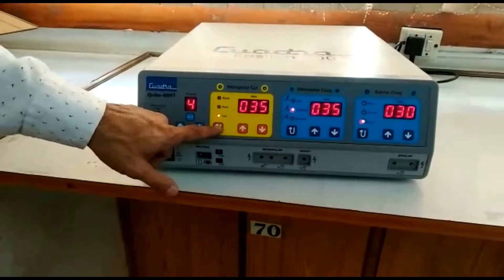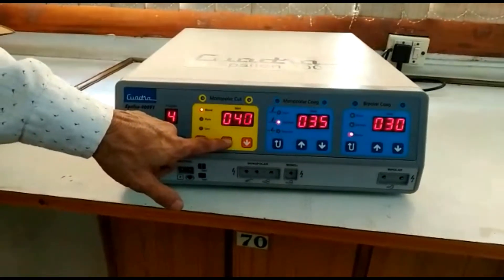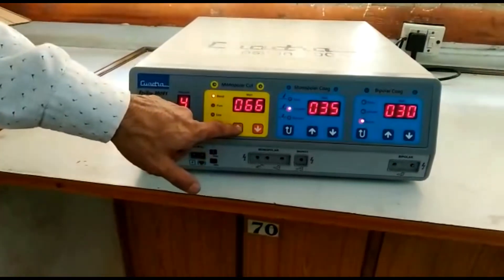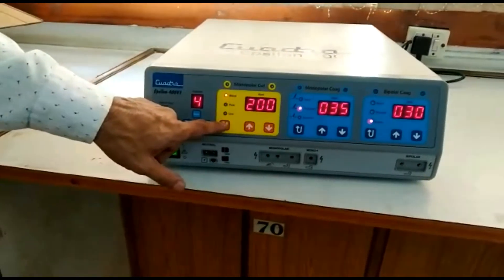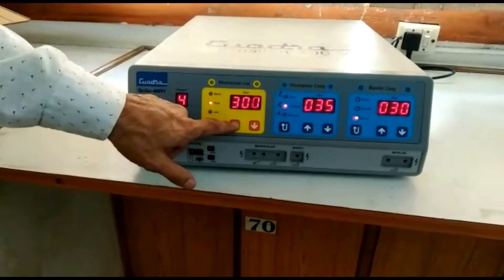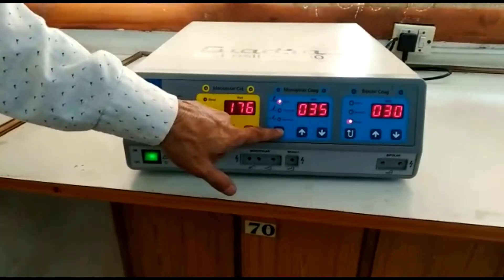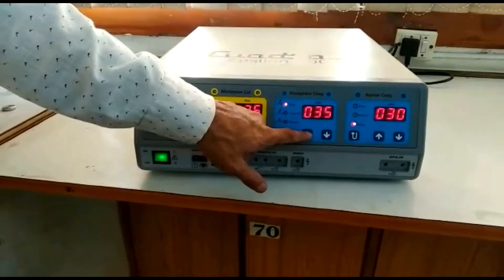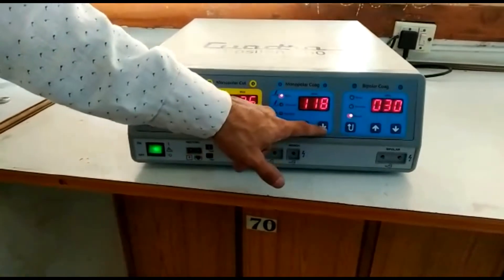You can change the modes for monopolar cut and increase or decrease power using the buttons in the monopolar cut window. The same applies to monopolar coagulation and bipolar coagulation windows. The maximum setting for pure cut is 400 watts. For monopolar coagulation the maximum power is 120 watts. You can change the mode using the toggle button or increase or decrease power accordingly.